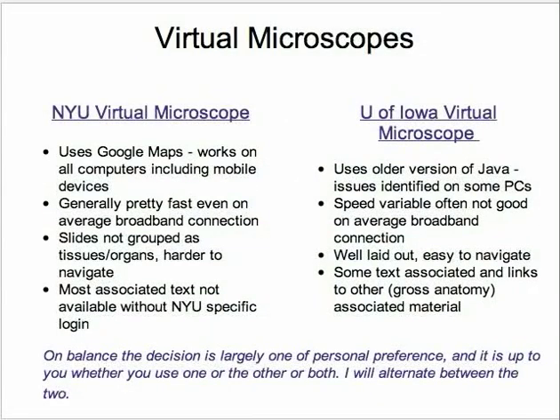This brief video clip is about the virtual microscopes which you're going to use to complete the practical element of the course. There are two publicly available virtual microscopes that we're going to use. In fact, there are more publicly available ones, but these are the ones that I'm recommending that we use. And on the screen here, I've put just a very brief comparison of the two that I'm proposing we use.